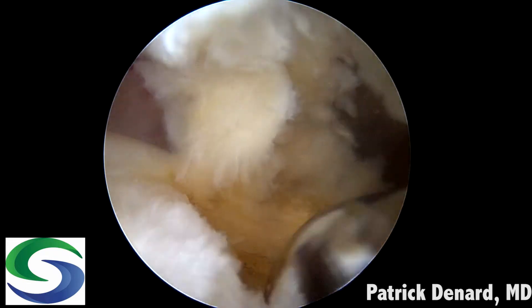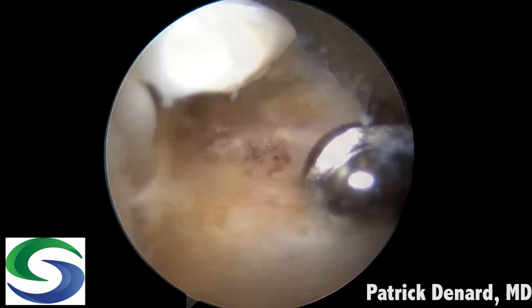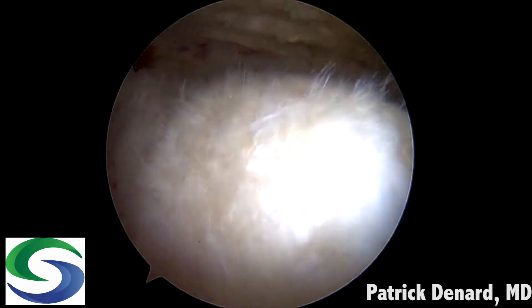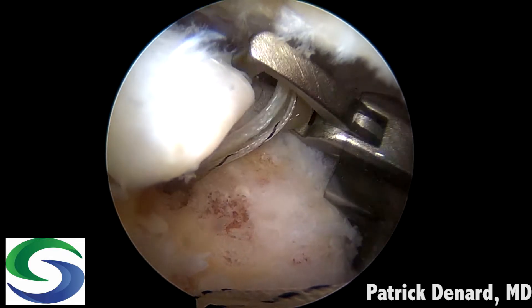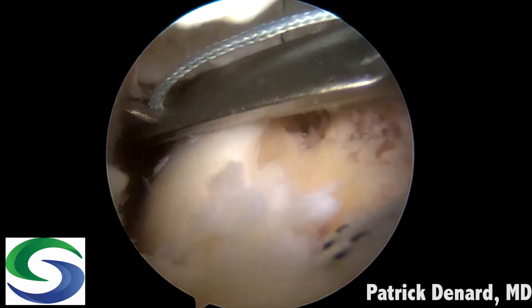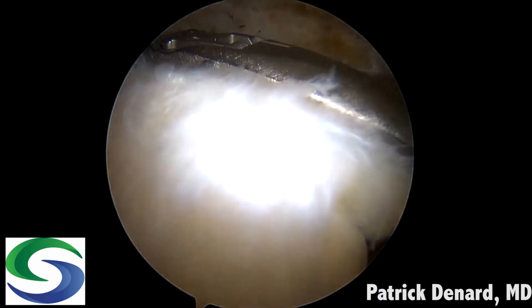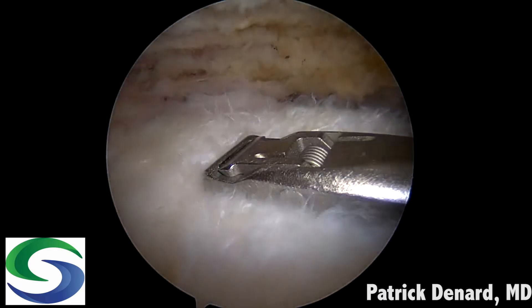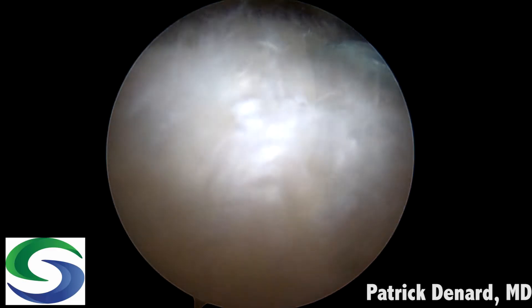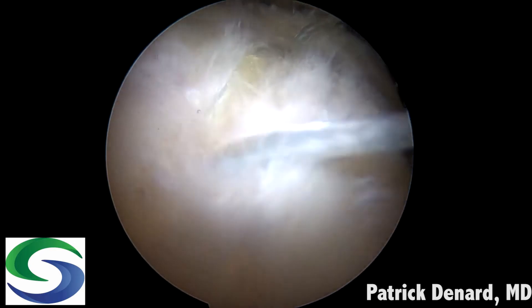Second case example, again illustrating the technique. This is a right shoulder in a female — she has a full thickness tear of the supraspinatus tendon with a small footprint. I place two 2.6 mm knotless fiber tack anchors. With the anterior anchor, we make sure not to pass the suture through the biceps tendon. I pass it through the rotator cuff and shuttle all the sutures through the tendon. Now both are through the tendon and we've created our double mattress suture.